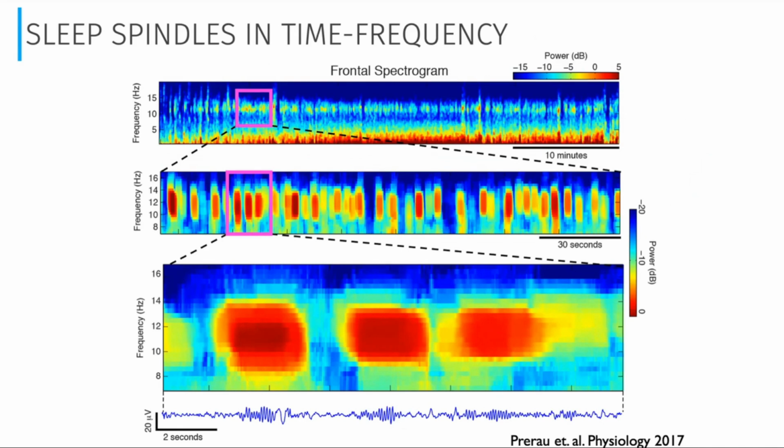And that makes sense, right? Because we're looking at things historically in the time domain, you can only pick out the biggest, juiciest spindles that occur at the periods of the lowest noise. And so that's essentially how our assumptions about spindle activity exist, from what people could see by eye in records from the 1930s and beyond. So what do we do in this case?